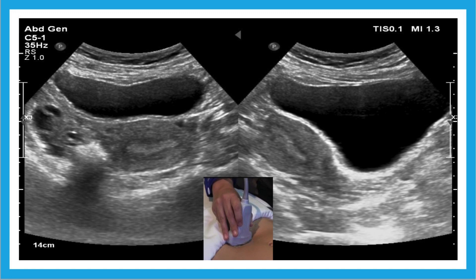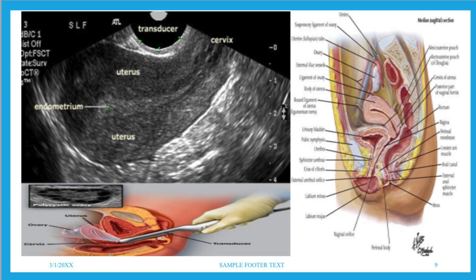Ultrasound can be done transabdominally — we use the full bladder as an acoustic window. It shows us the anatomy all the way from the skin, the abdominal wall, the urinary bladder, the uterus including the myometrium and endometrium, and the ovaries. Transvaginal ultrasound also shows us the anatomy and is very easy to correlate with an atlas.